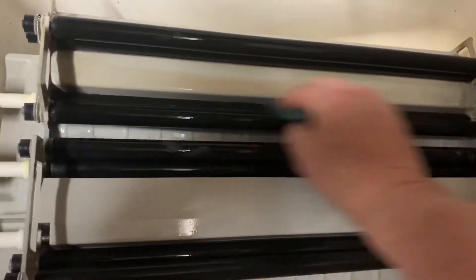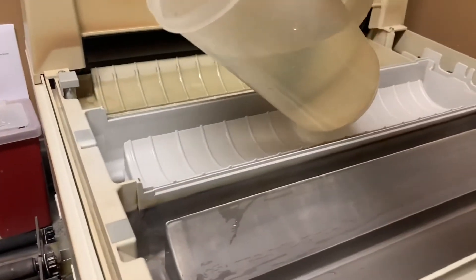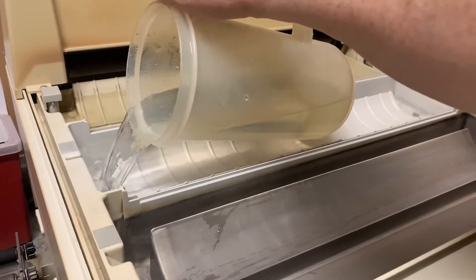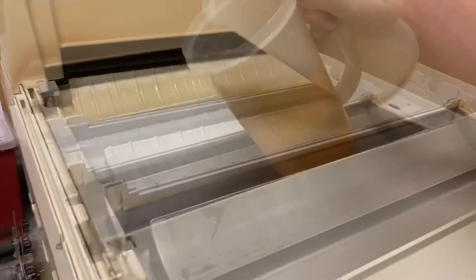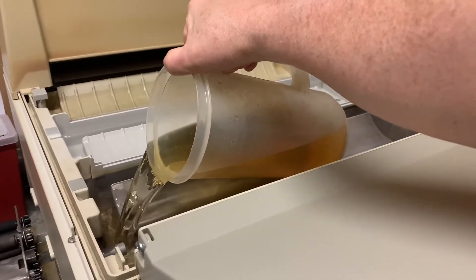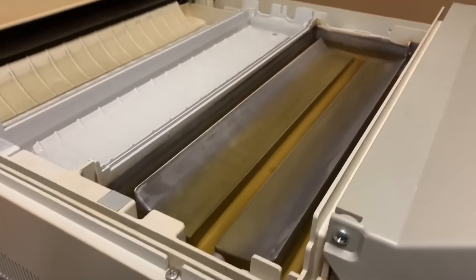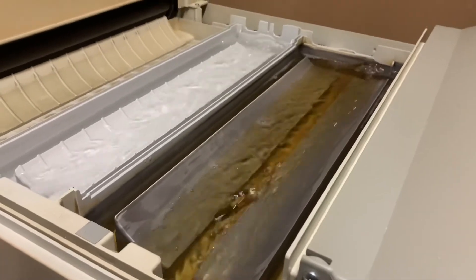We'll thoroughly scrub all the old chemicals off the rollers and further inspect them to make sure there are no cuts, tears, or peeling on any of the rollers. Then we will refill your processor with fresh fixer and developer to the proper levels.